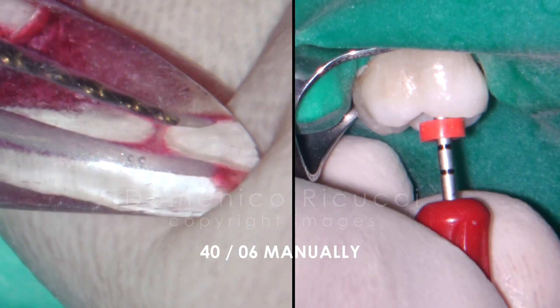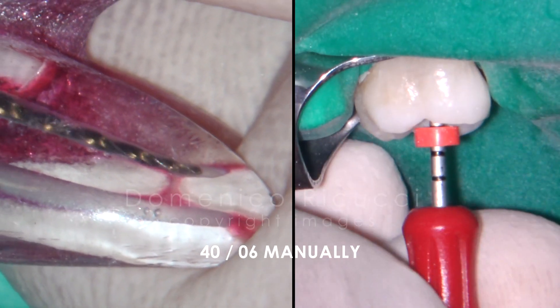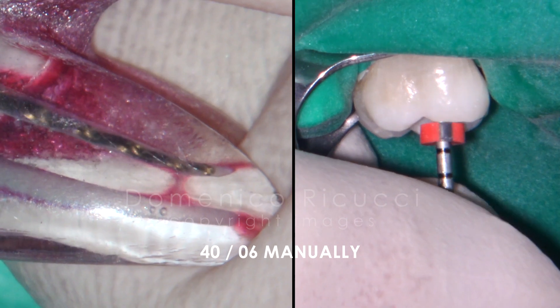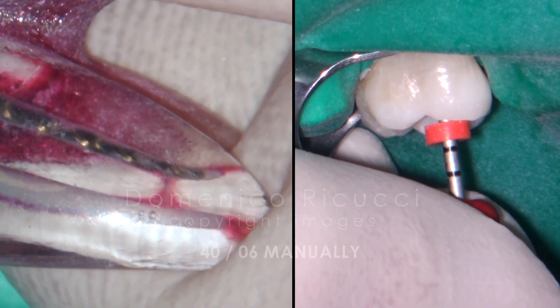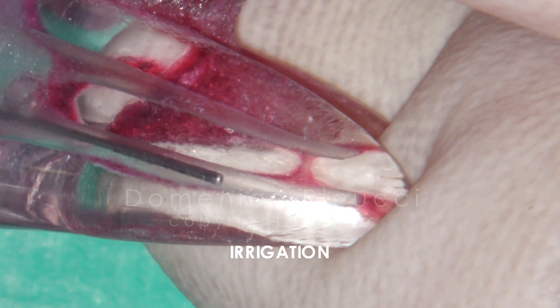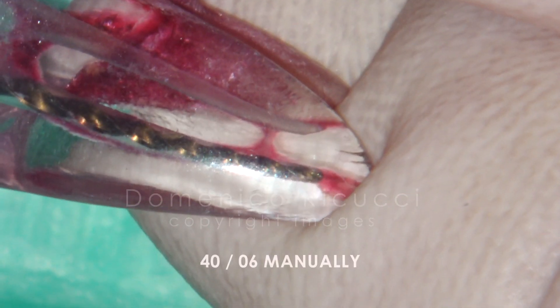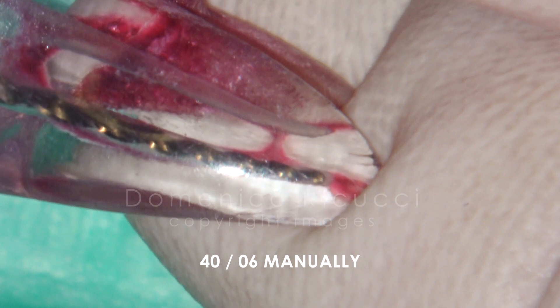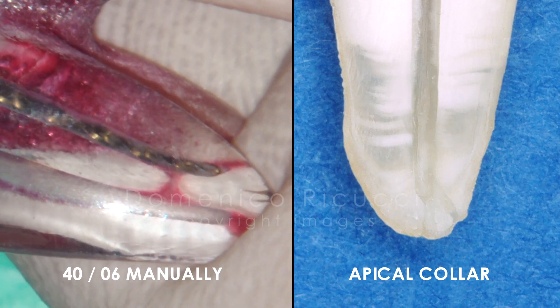Use a 40-06 file manually. Note the apical stop or collar that is being prepared.